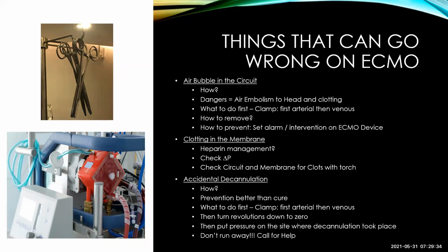So now when the patient is in the ICU, the only other way that air can come into the system is via your central venous catheter. So be sure that when your lines are running freely without a pump, you are going to get air into your system if you don't close them off nicely. So keep your eyes on blood and FFPs running freely.